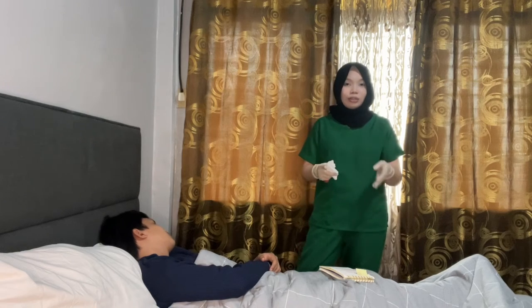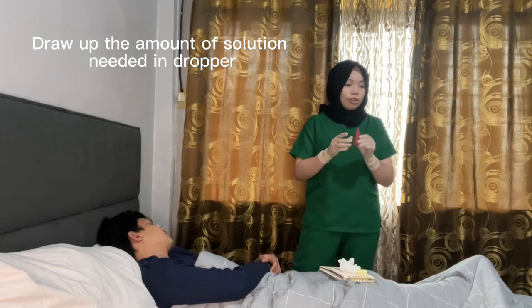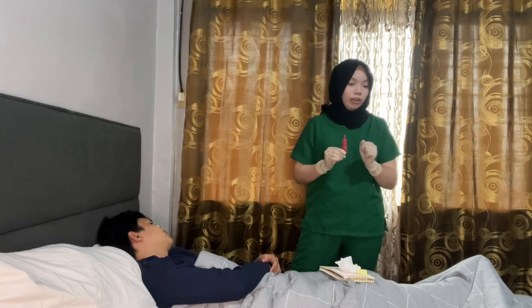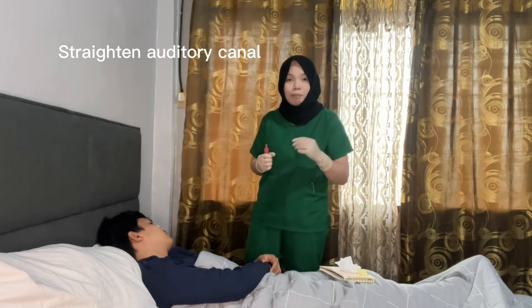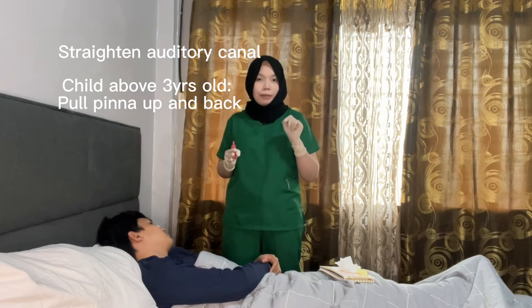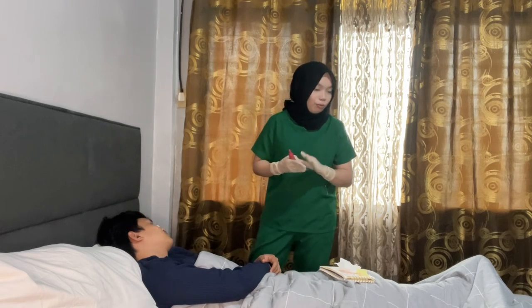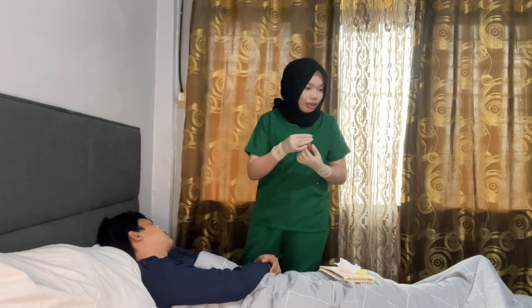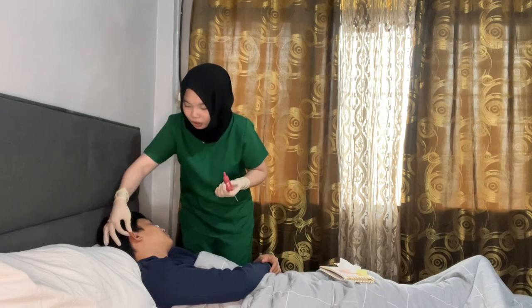Next, administer the otic drops. Draw the amount of solution into the dropper and do not return any excess solution to the stock bottle. Straighten the auditory canal by pulling the pinna up and back — for adults, pull the pinna up and back; for children, pull the pinna down and back. Pull the pinna up and back.